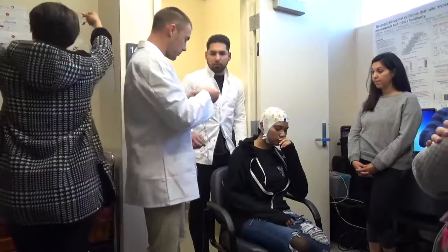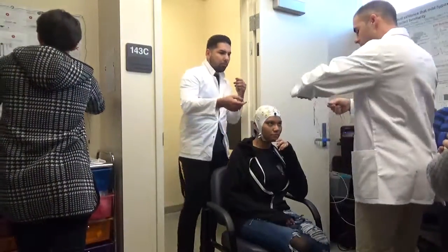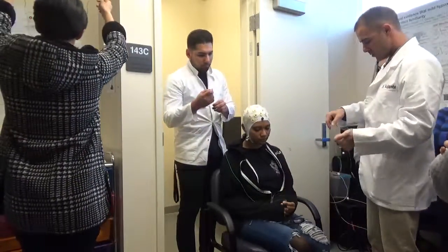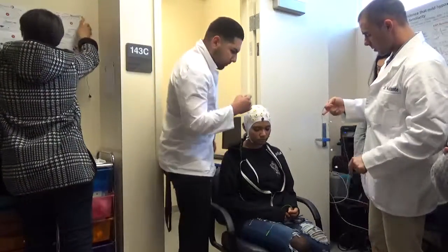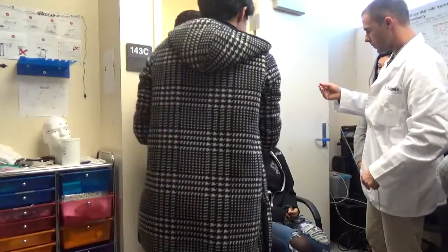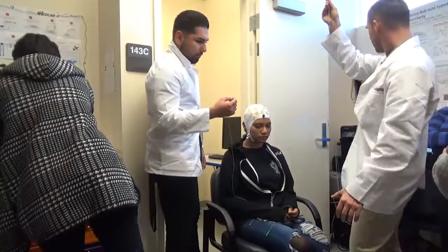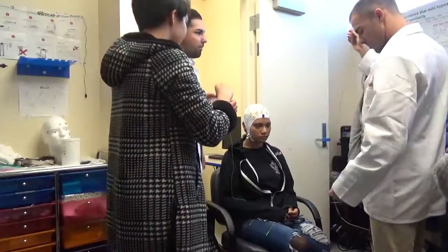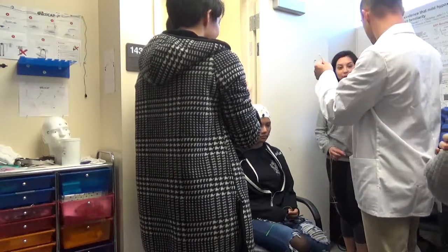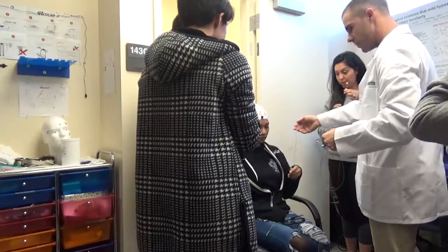So you want to grab one of these? Yeah. What you can do is you can ask them to hold this back end. You just hold it in your lap, it's fine, no real rush. And you want to put a sticker on it. Okay. Are those inside? Yeah. Can you pass a few stickers? Yep. Okay. I'm going to recruit you. Okay. Do you want a lab coat? I'm okay. Okay. Yeah. Can you hold that circle? Okay. And can you hold that end?